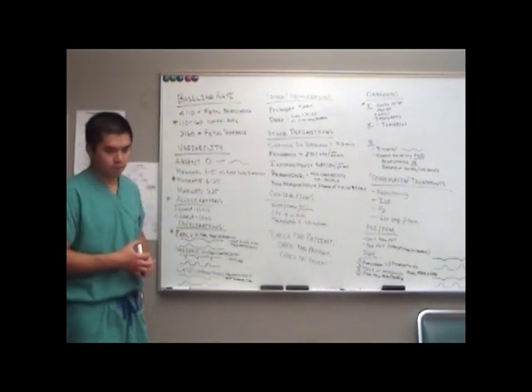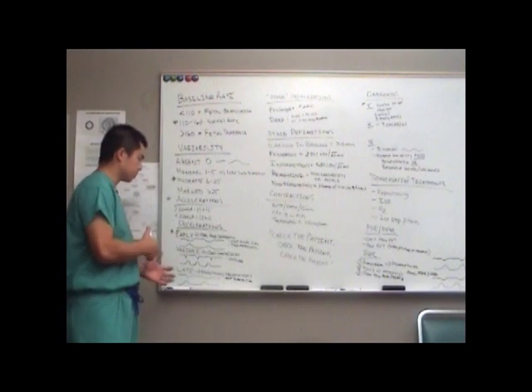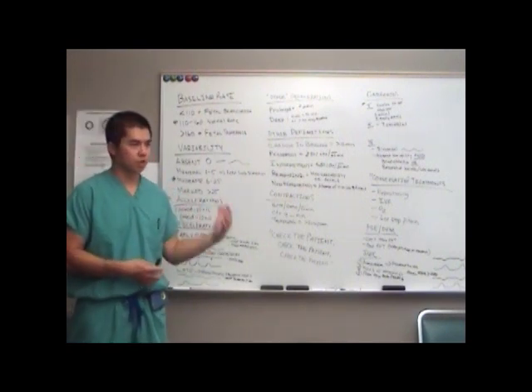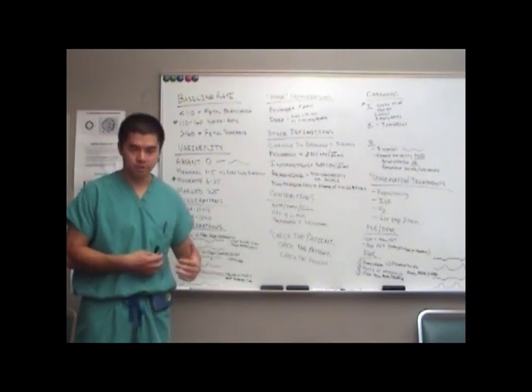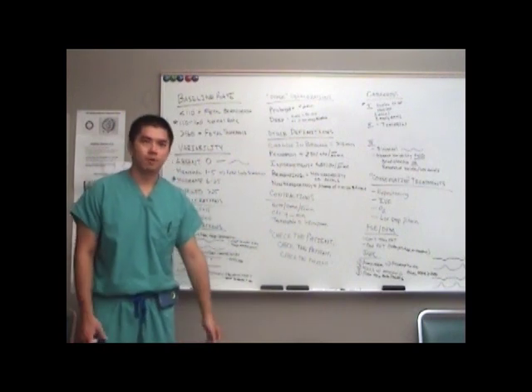And then whenever you have a concern or a change in the clinical status in your fetal heart tones or your patient, the first thing that you always do when you enter the room is you check the patient, check the patient, check the patient. Another thing is a late is always a late is a late, no matter how subtle it is.